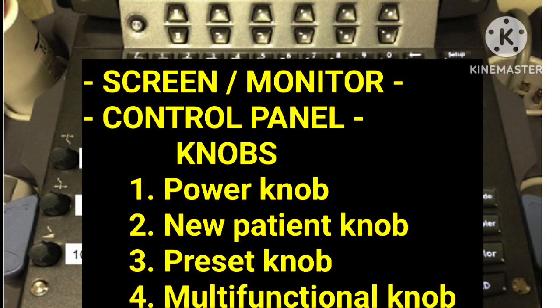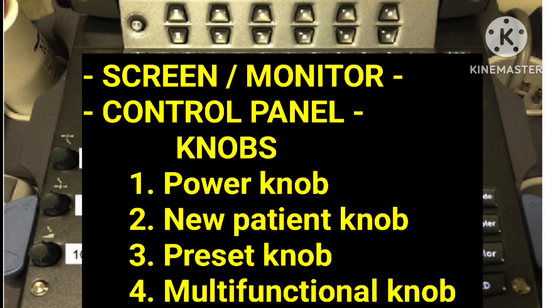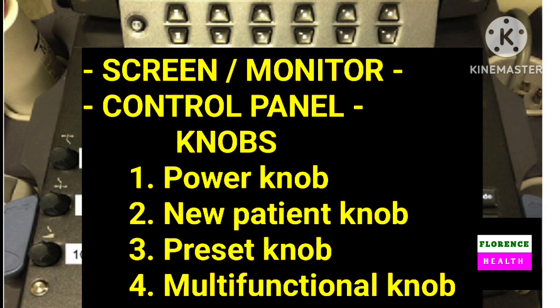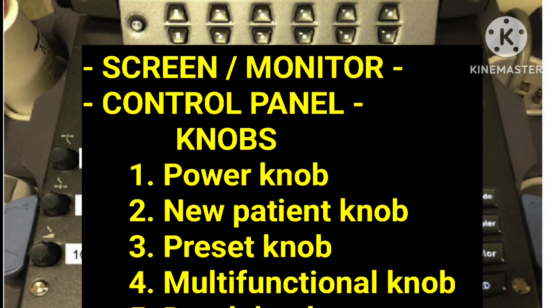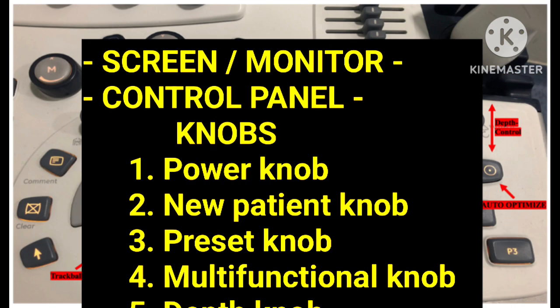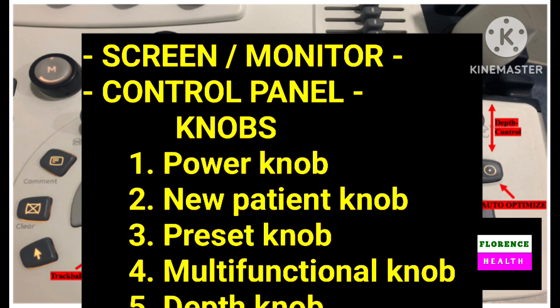Depth is inversely proportional to resolution or quality of image. Depth is also inversely proportional to frame rate. By decreasing the depth, the resolution or quality of the image increases. By decreasing the depth, the frame rate increases. So, a good quality image will be produced.